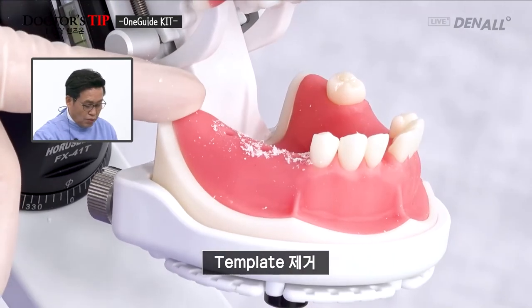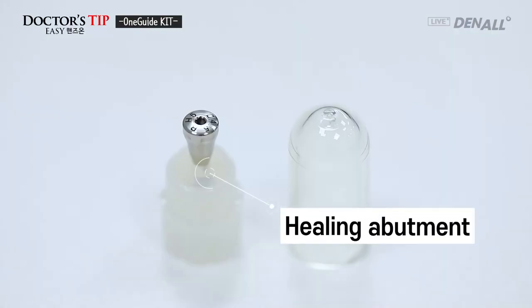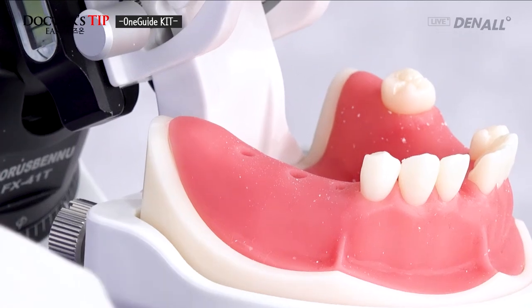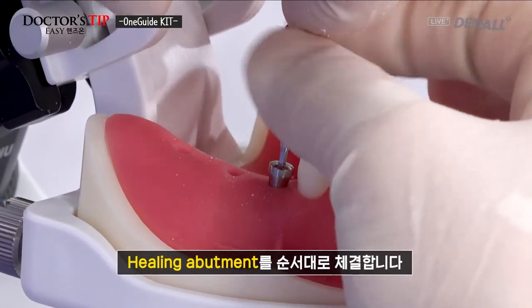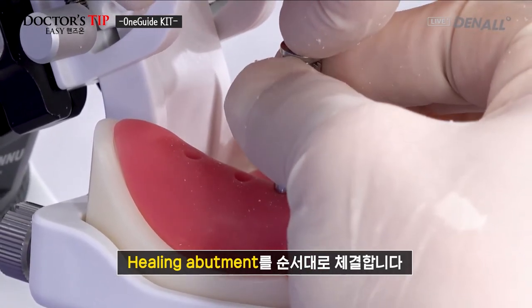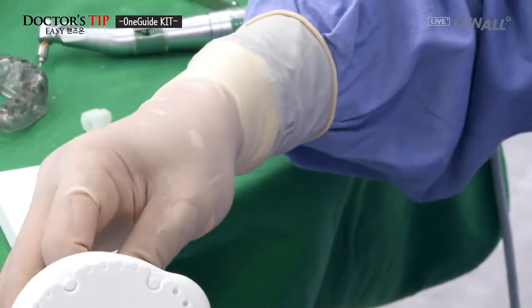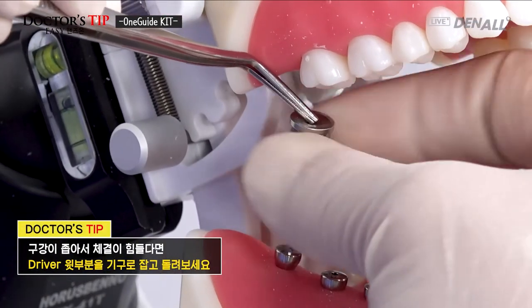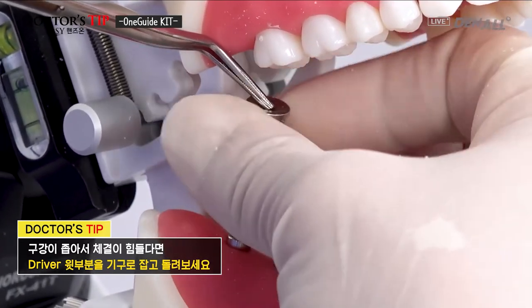remove the template. Connect the healing abutment to the implant placed. The healing abutment that was planned is going to be placed on number 45. The same with number 47. If the patient's mouth is narrow, you can use an instrument to hold the driver and you can attach the healing abutment like this.